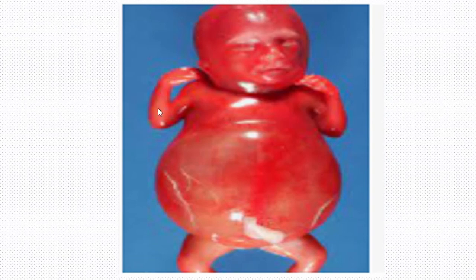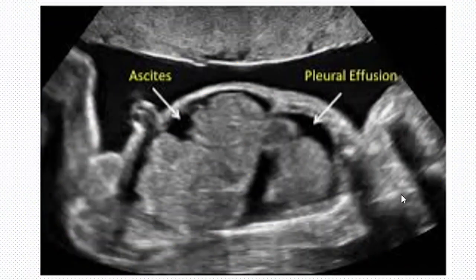The fetus can have edema or fluid just below the skin. You can also have fluid around the scalp accumulating when a fetus has this condition, called hydrops fetalis. This is a sonographic image demonstrating a typical case of hydrops fetalis. We can see the gravid uterus, this is our placenta — an anterior upper segment placenta — and this echogenic layer is our chorionic plate.